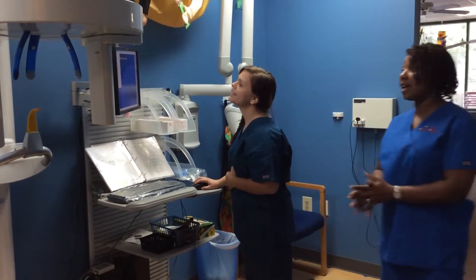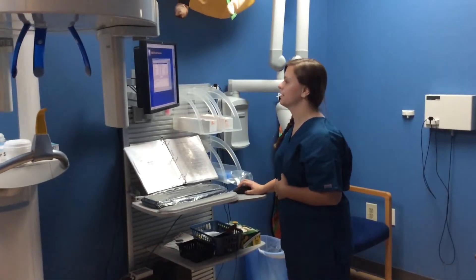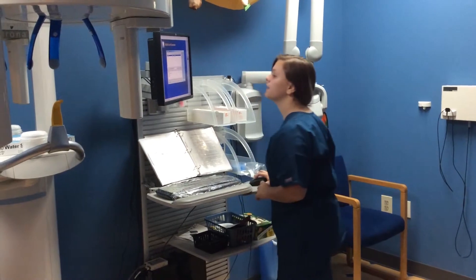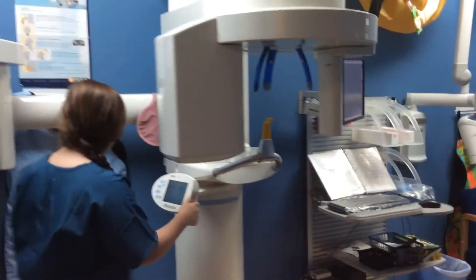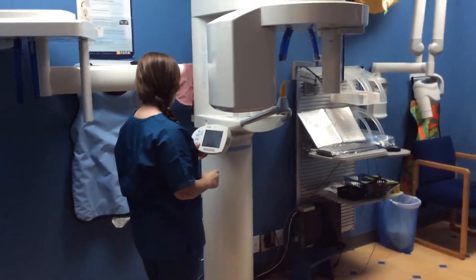I'm just going to act like your patient, and that's it. Ms. Robin — and this is only her fifth time — she's doing awesome, she's doing very well. She's got great memory retention, so I'm just going to watch her do what she does.